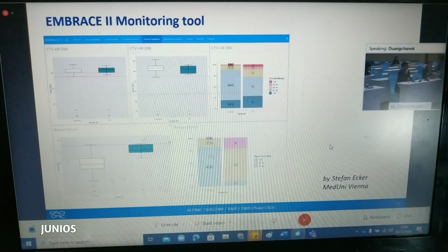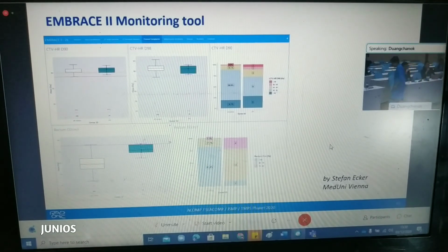So you learned, I thought in the last slide, that the dose position becomes more of a concern. I saw in many cases that they try to decrease the dose to the vagina. But the recommendation in EMBRACE is that mostly people try to keep the vagina at about 30 to 40%. Is there anything?